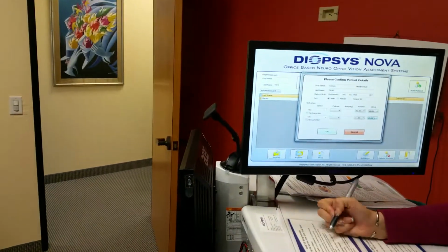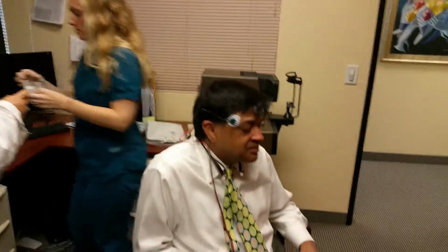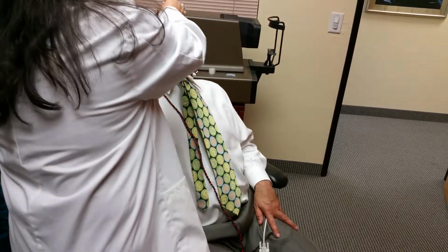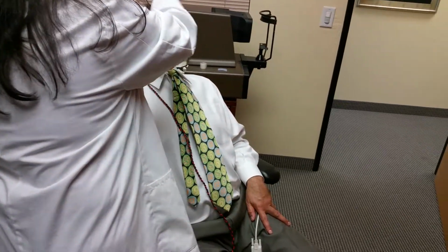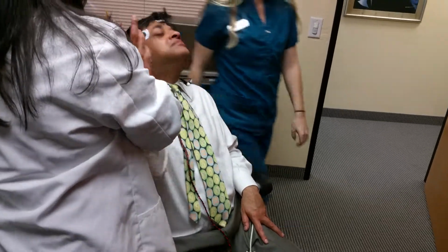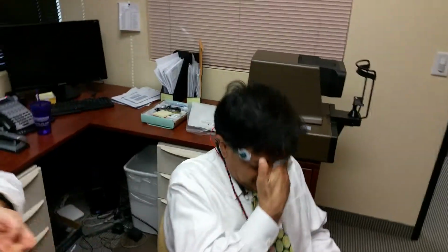You guys need to get a nice smooth dialogue where you recognize, if you look over here on your cheat sheet, it will actually tell you to tell the patient, watch the screen as if you're watching TV. Look at the center of the screen, relax and focus on the changing pattern. You may blink as needed, please no talking. The only thing this doesn't do that I do is address the red target. Because if you don't say anything about it, your little ladies, especially whenever you start the test, are going to be like, well, there's the red circle. Am I supposed to look at that, or what am I supposed to look at?